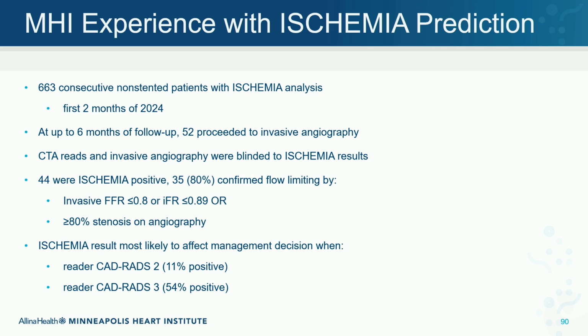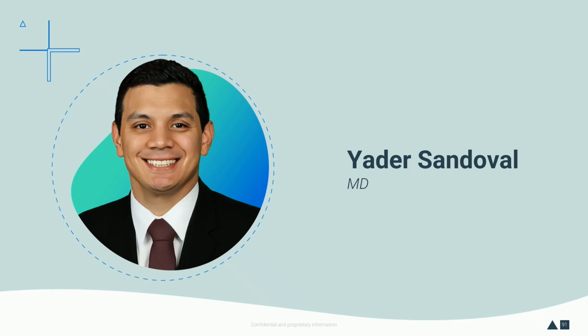And then on the bottom there, so far we've found that when our readers are reading CAD-RADS 2 or 3, that is when the ischemia tool is most likely to affect our management decisions. So we're going to continue with this, right, with Yader next.